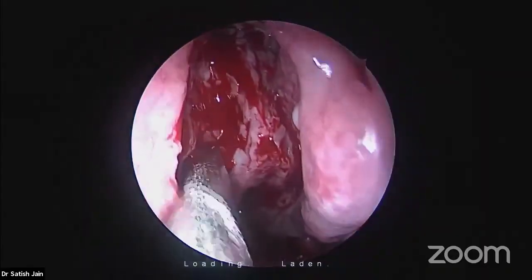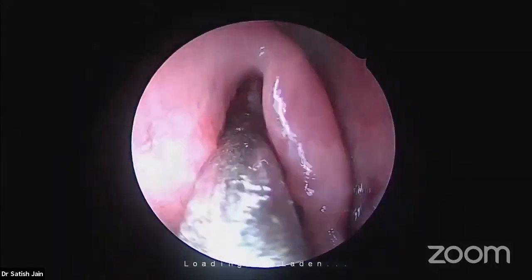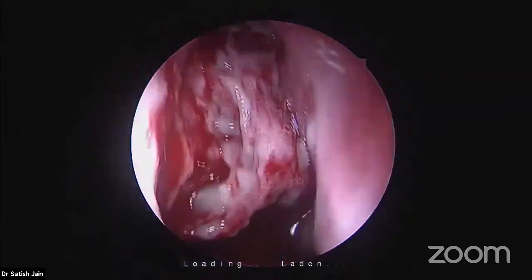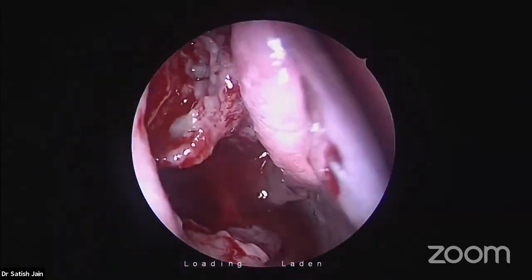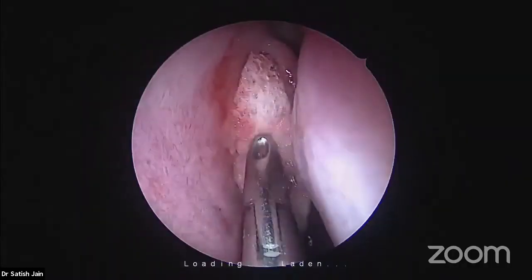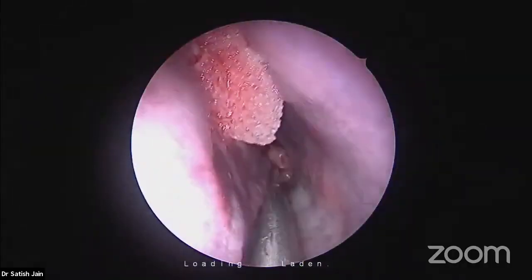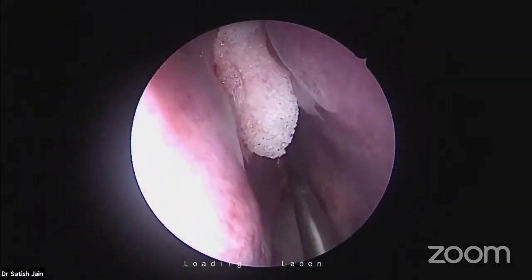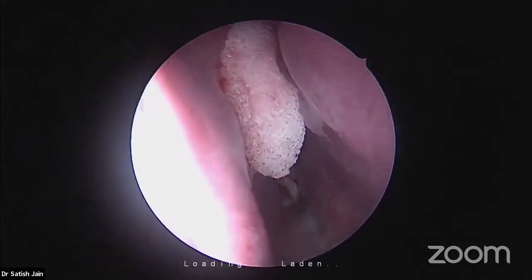At this step, there is a reason, I will tell you, we changed to 70 degree to do the frontal sinus work. For the reason I'll tell you, because we have more landmarks at this point of time to carry out a safe and an easy frontal sinus work. Let me tell you. This is the point. And the thing which is important behind that is the 70 degree. Without 70 degree, one cannot carry out a good, confident, complete, comprehensive frontal sinus work. Believe me.